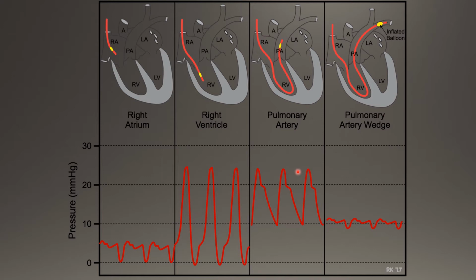Now we're going to look at this. It's a dicrotic notch on the right. Looks very similar to your A-line waveform. So when you have these two right next to each other, they don't look that similar. But if you're seeing them on your monitor, this is something that you can pick up on. If there's an anacrotic notch on the left, then that's in the right ventricle, and that's a big deal. That's a big problem. We've got to get that fixed. If it's a dicrotic notch on the right, you're good to go. Right is right placement.